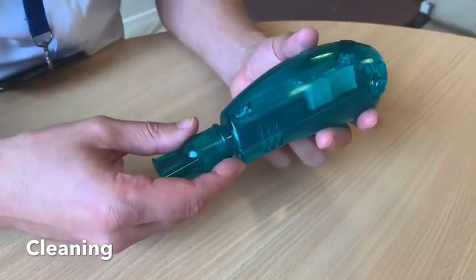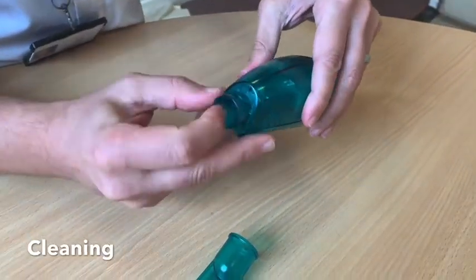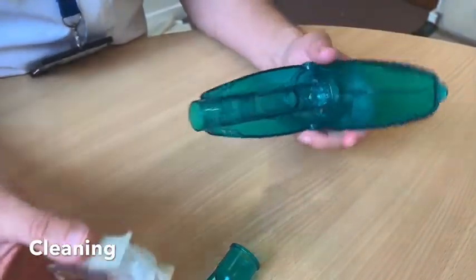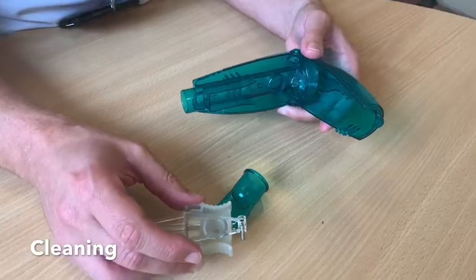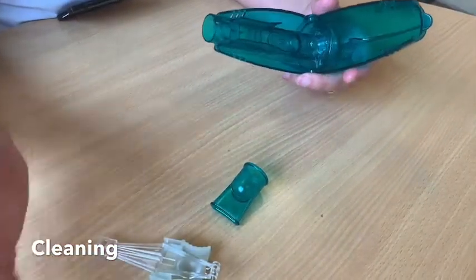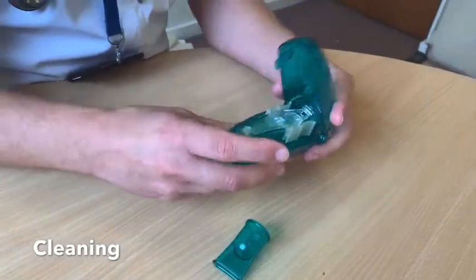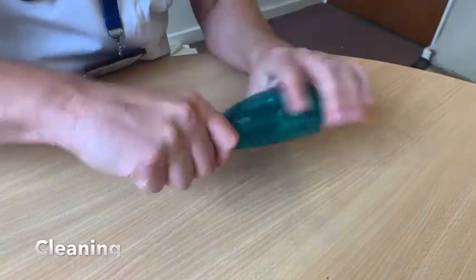To keep the device clean and functioning well, it comes apart quite easily. Take the mouthpiece off, then the lid pops up, and inside is a little seesaw that provides the oscillations — there's a little magnet and a strip of metal. I'd recommend you pop all three parts in a bowl of warm water with some washing-up liquid, give it a gentle rinse, then leave it to air dry. When you're ready to use it again, clip it back together — the seesaw will only fit in one way — close the lid and slide the mouthpiece on, and you're good to go.